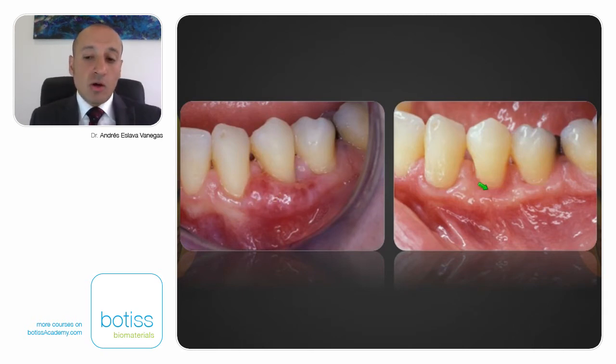And you can see almost a complete root cover of the initial gingival recession. And we can get some keratinized tissue. Okay? You can do that with connective tissue grafts.